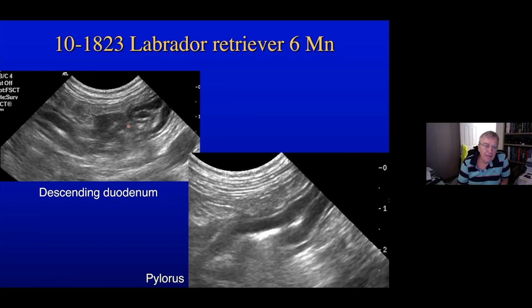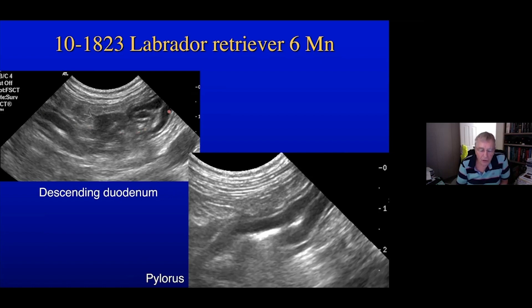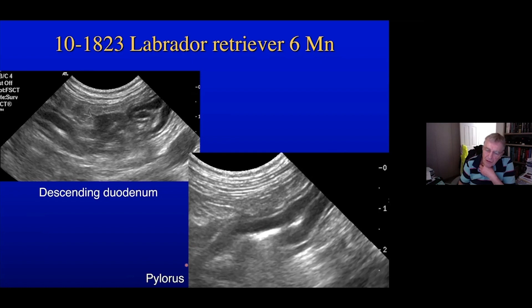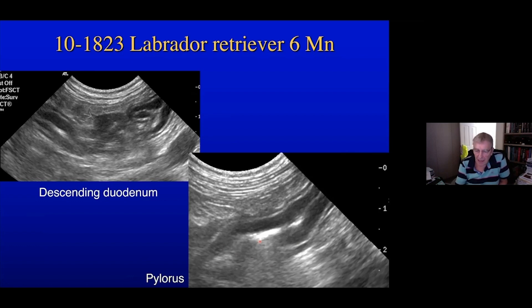The duodenum looks fairly abnormal — normally it's quite a straight organ, but here it's rather tortuous, which usually accompanies inflammation either within or surrounding the duodenum. We can follow the duodenum up to the pylorus and the pyloric antrum, which is open, with some ingesta coming into the duodenum.